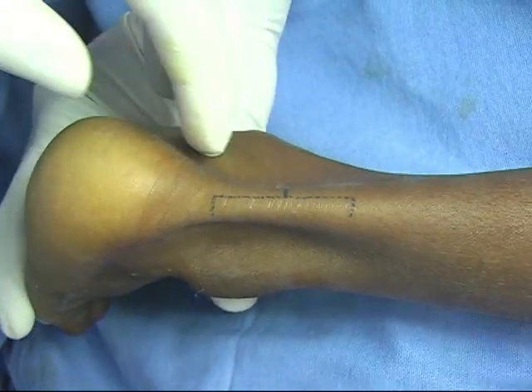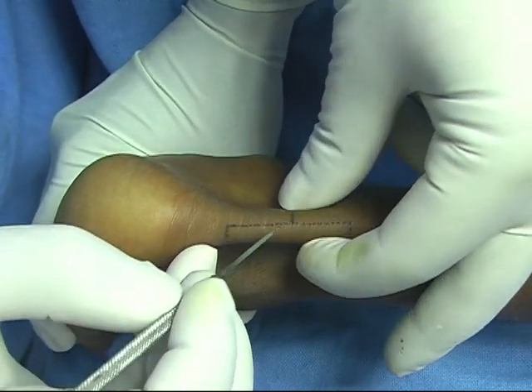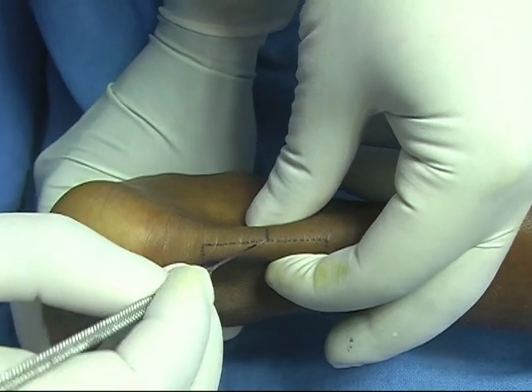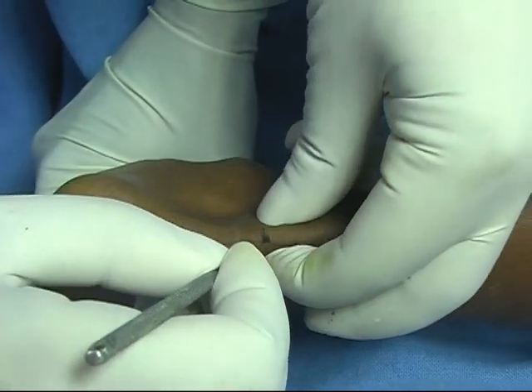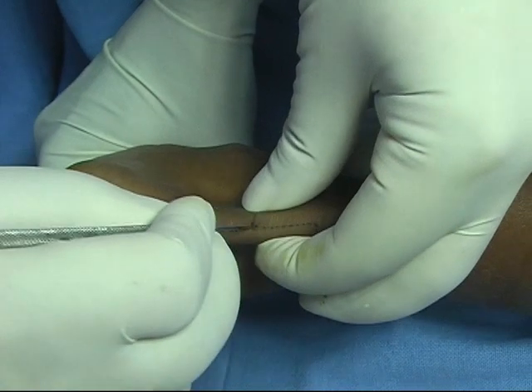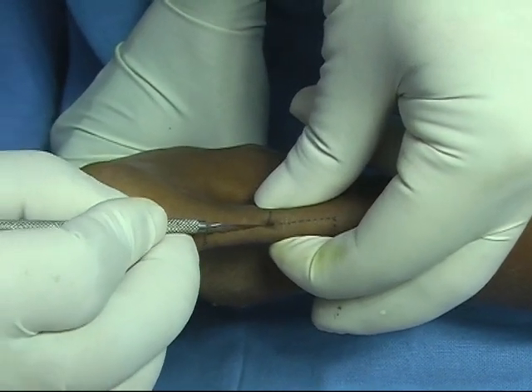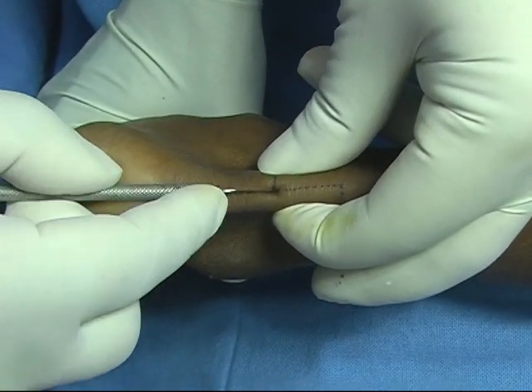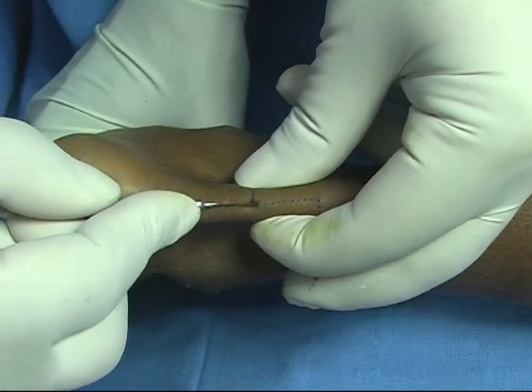Assistants, dorsiflex the foot — now I will make a puncture here. Stabilize the skin and dorsiflex it. Puncture in the center here. Pull the skin up and go deep down, deep down, as I am going here. Then keep the edge of the knife towards the roof. Tilt it, advance it closely — don't move the skin. It is going deep, to break the fibers without making a cut in the skin.